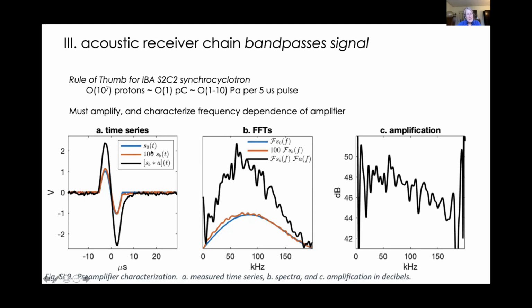We have to attenuate before we amplify, because we're amplifying so much that if I send in a signal that I can actually measure on my oscilloscope to my amplifier, I blow out the amplifier. So I had to attenuate, which is my SB signal. And you can see the attenuator is pretty faithful. It doesn't do half bad a job, that 40 dB of attenuation. And then my amplification is good. So it gives me more than 40 dB of amplification, but you can see the pulse shape has changed.